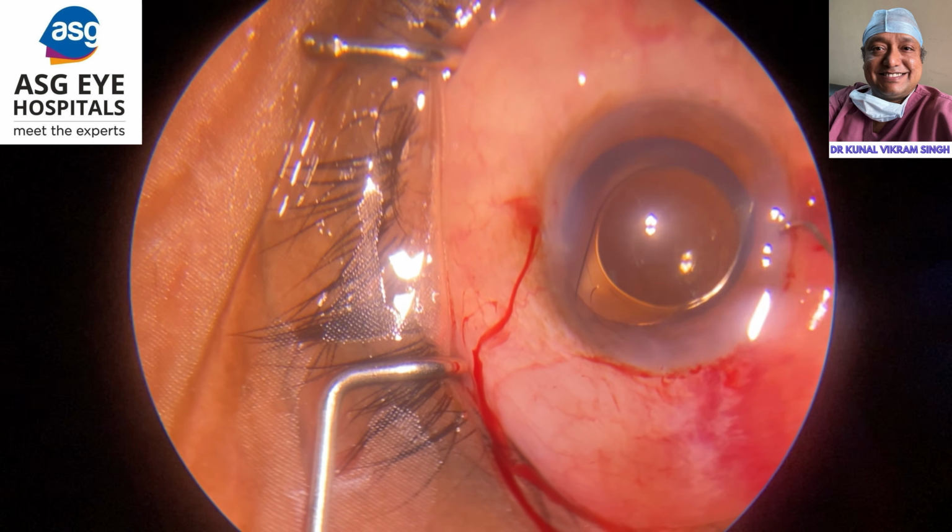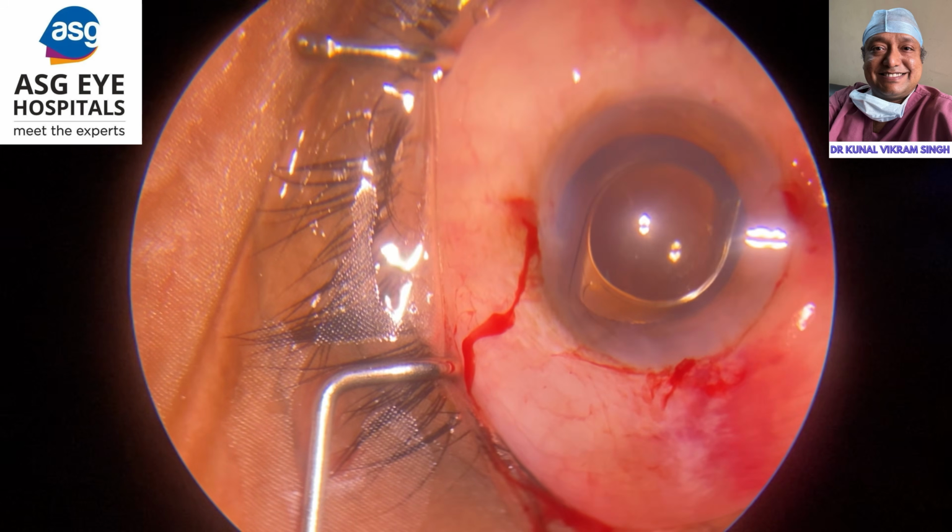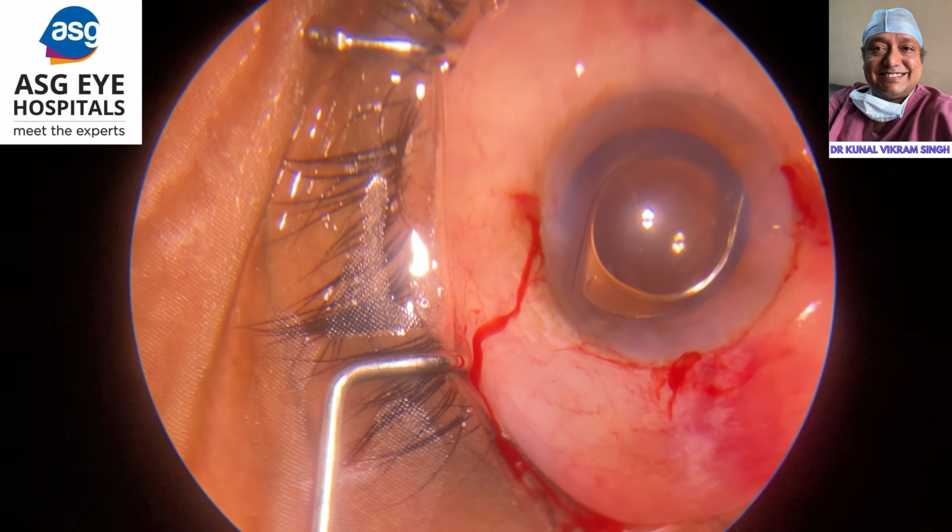As you can see, I've been trying to maneuver the haptic from all the ports wherever possible, from the left side, from the right side, from the main port.